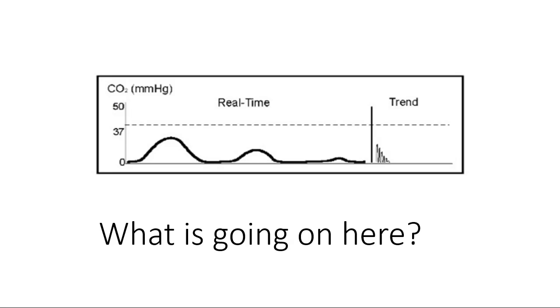I'm not real happy with this waveform, but we have a floppy waveform going down more and going down more. And here's your trend, came up high and went down quick. So what's going on there? This is a patient that you just intubated. So pause and contemplate.